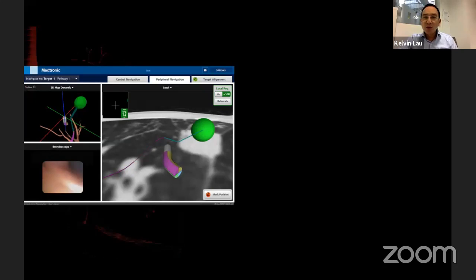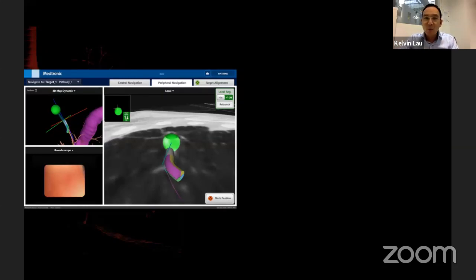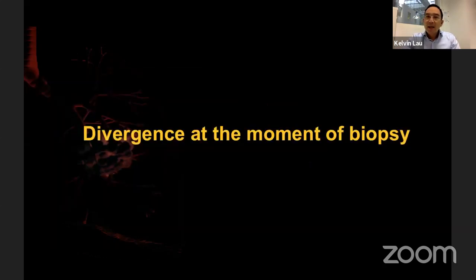And what happens when you do the tomosynthesis and correct it? So here you can see this is my navigated position to the nodule. And then I corrected it, and you can switch on the correction. And you see, oh, suddenly I'm actually much more aligned with the lesion than I thought I was. If I didn't know that and I was on the left-hand side lesion, I would keep trying to navigate and move it, but actually I'm there already. And vice versa, here is an example where I'm at the lesion and I thought I'll just go and biopsy it. You do the fluoronav, and then you check your position. Actually, you're not where you thought you were and you need to readjust your position. So that's correcting for the lesion.